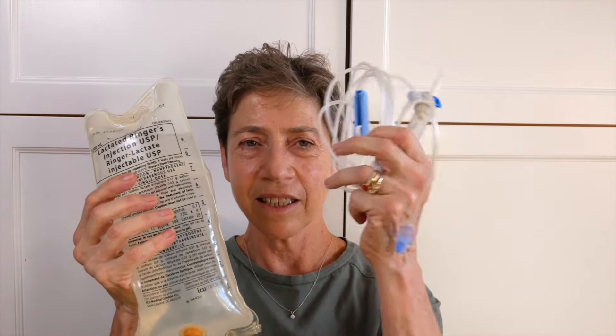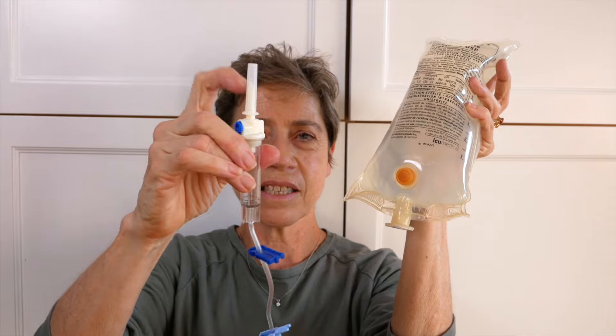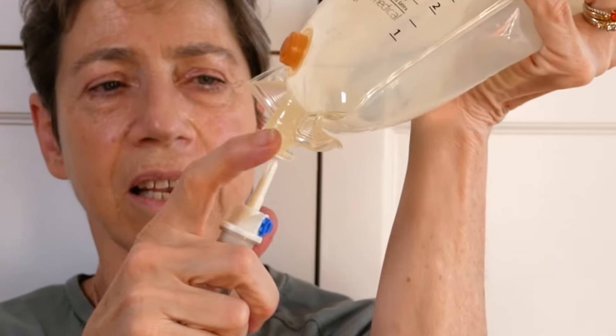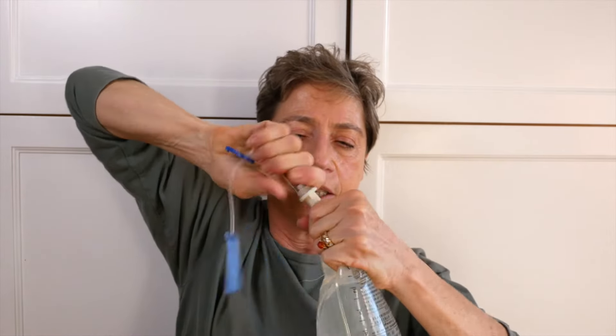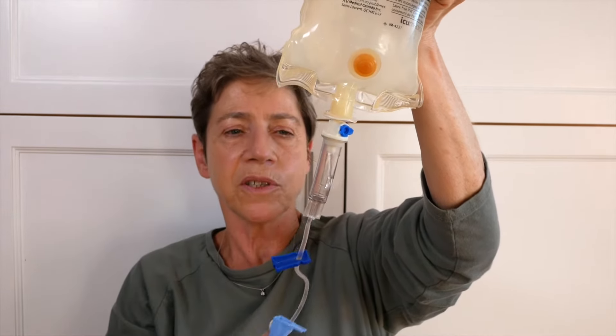The first thing we need to do is connect the bag and the line. Here's a bag of fluids and here is a line. We've got to take the bottom end off of the bag, which is actually easier than it looks. With that end out, I'm going to attach this sterile hub into this opening. This takes a little bit of pressure, so you want to get it all the way in, right to the hub, and then the fluids will start running.